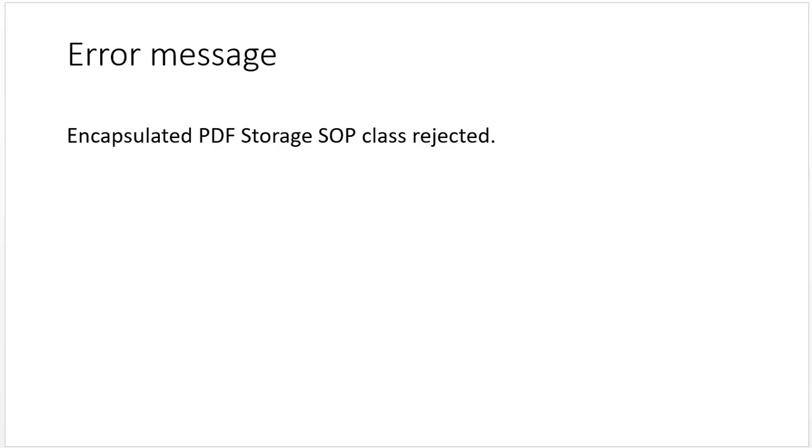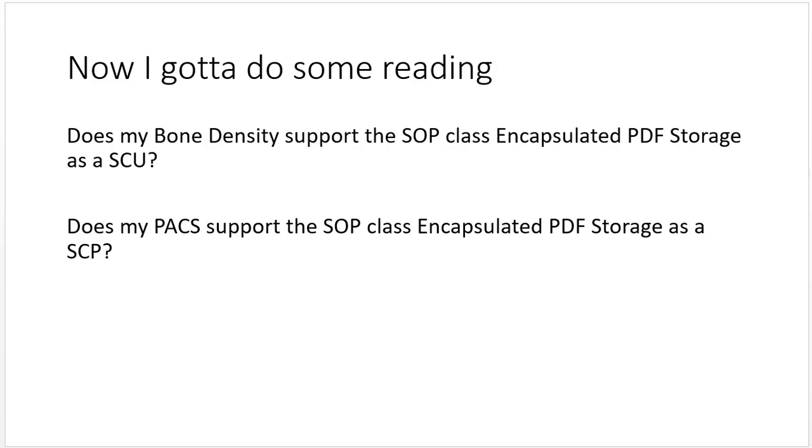When the tech clicks send, there's an error saying one or more files were not stored. You check the bone density unit send log, and you find the error: encapsulated PDF storage SOP class rejected. Oh, I wonder if that SOP class is supported by this unit. So now is the perfect time to pull out your DICOM conformance statement. Right? So I got to do some reading.